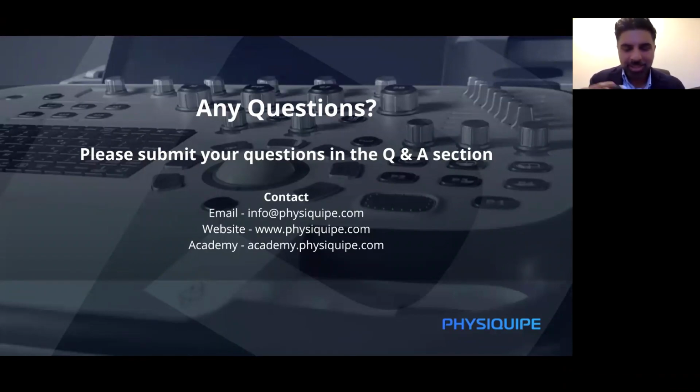And when I say see them within a few weeks, they have to have a diagnosis and treatment within 6 weeks of seeing you as well. So referring them to radiology is not the answer. So we have to see them so we can give them a diagnosis. This is how ultrasound fits with that. It's meeting national standards.